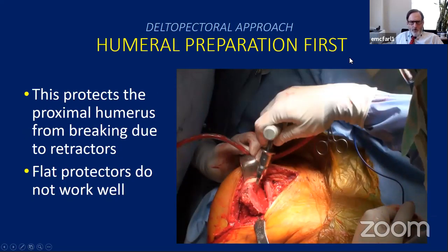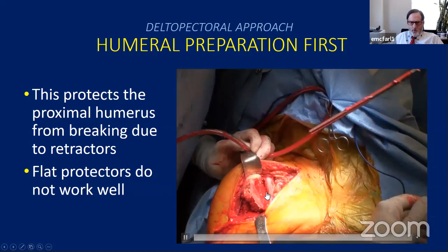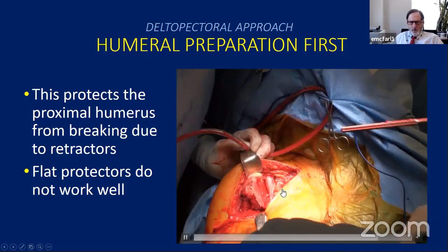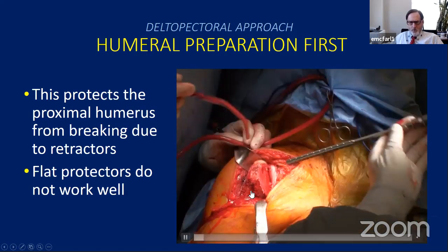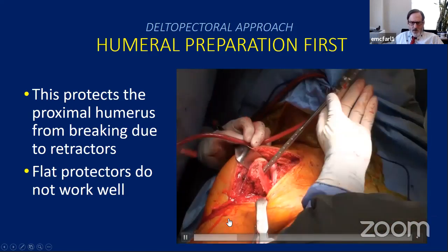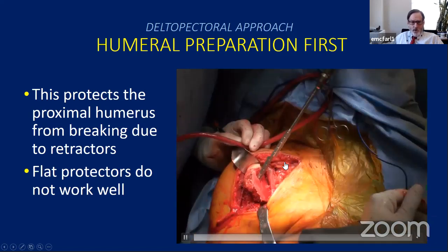So then we prep the humerus. The key thing when prepping the humerus is, if you notice, we bring the arm down into an adducted position down here, so that when we're not working in the shaft, we take the tension off the brachial plexus. This has helped us a lot prevent getting plexopathies. The other thing that's real critical is this thing needs to be able to go straight down the shaft. If you put it in at an angle, I haven't seen this happen much anymore, but earlier in my practice, people would stick the prosthesis out the lateral side of the humerus. That's a bad thing. So you want to make sure that you can get a straight shot. And again, this has something to do with even positioning of the patient.